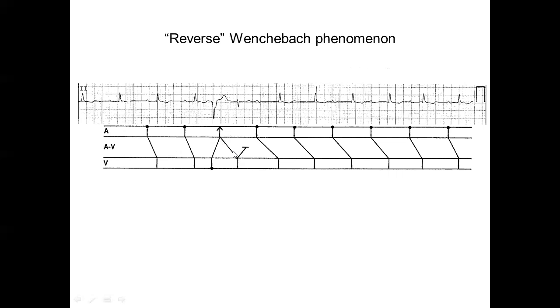So this patient is set up for AV reentry, and without that, it won't come back this way. So this is an echo beat. Then now try to go back to atrium. It didn't make it, but it disturbed the AV junction enough so that when the next P is going to conduct, it's going to conduct with a longer PR interval.